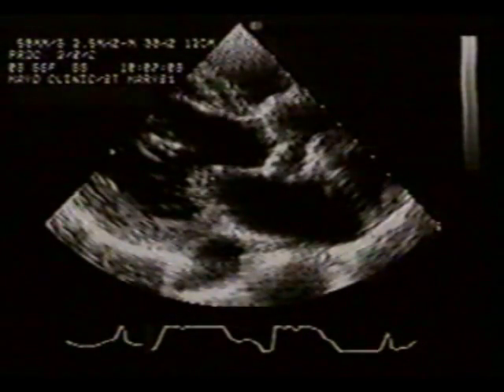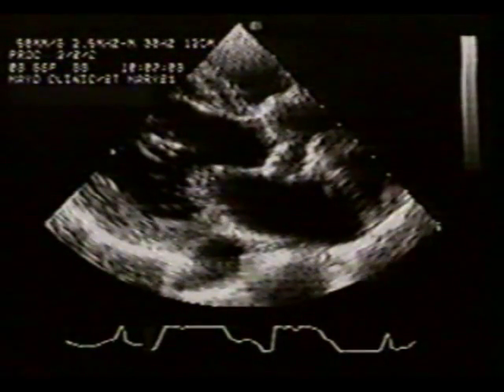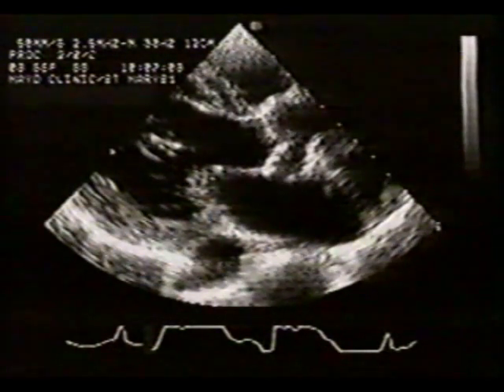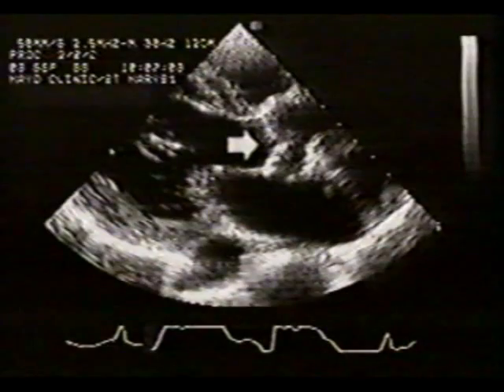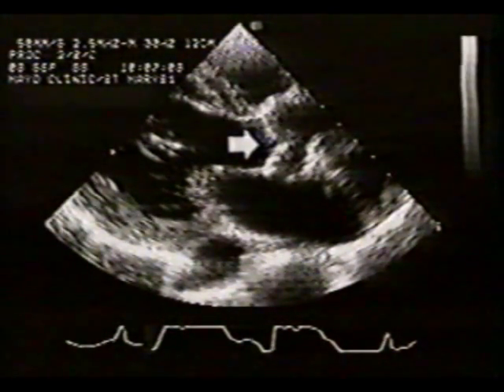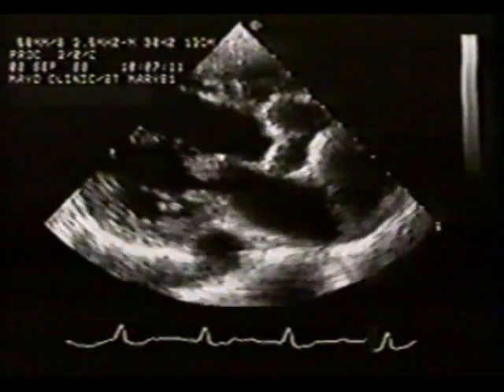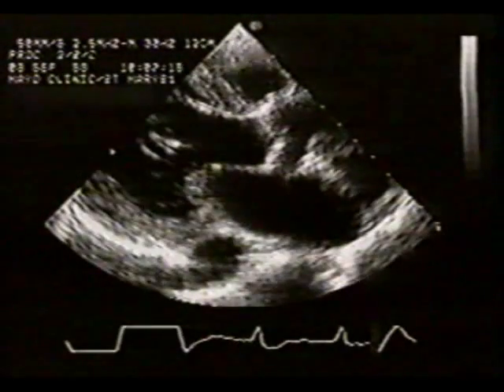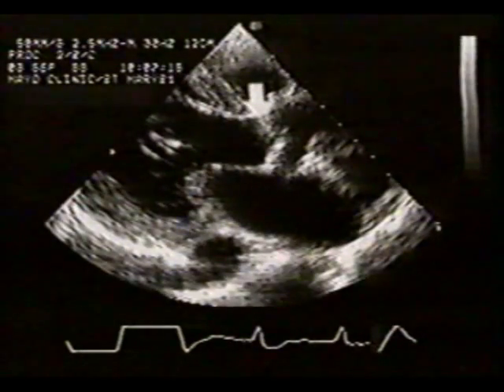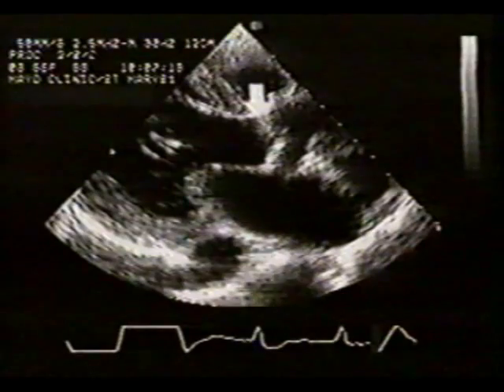We will now review the 3 steps in calculating the aortic valve area using patient examples. This is a parasternal long axis view from an 87-year-old female with aortic stenosis. We will play this briefly in real time and then freeze the image in systole. The anterior caliper will now be placed here at the junction of the anterior aortic cusp and the ventricular septum.